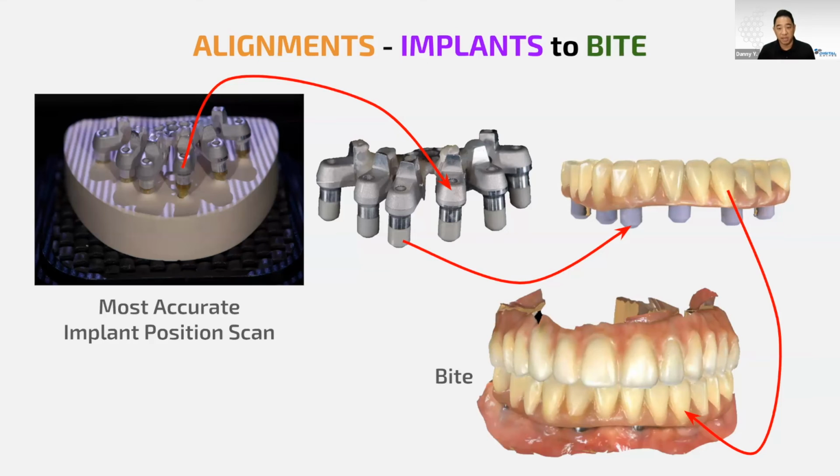And so now we have the implant positions and the bite in the same three-dimensional coordinates, just like we were hoping for.